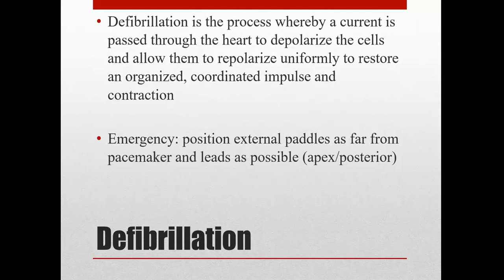Really nowadays, we don't really use paddles. We use pads that attach to the monitor, and then nobody even has to touch the patient whenever we shock them. But sometimes they do still use internal pads, like in cardiac surgery. They literally look like little mini paddles, and they go on either side of the heart, and they shock them that way. But it's internal.